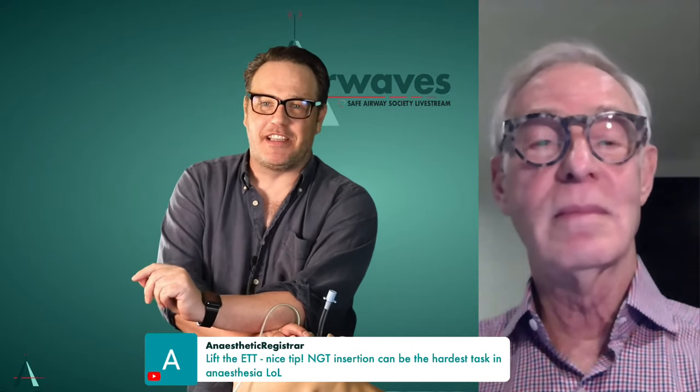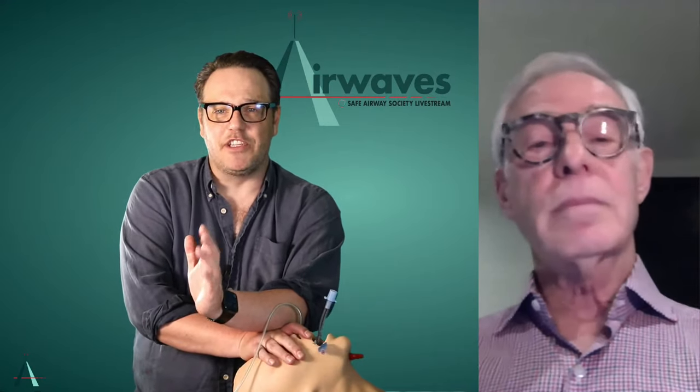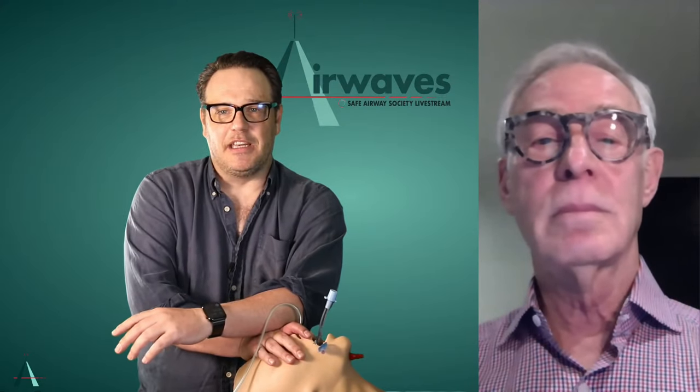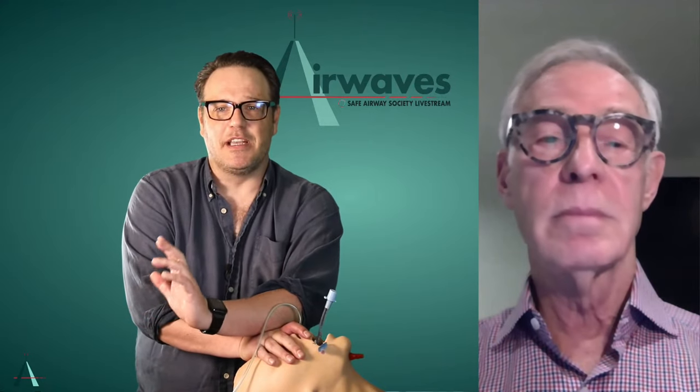Richard showed me these techniques a bit over a year ago, and really the important part of this is that you commit to using a hyperangulated blade by default for an extended period to get up the skill set. I did that with the intent of, as Richard mentioned earlier, if you don't get good at this, you won't have the skills to use it in the setting where you really need it. So most of the time you won't need the hyperangulated blade, but it does have some other benefits, I think, even in a routine setting.